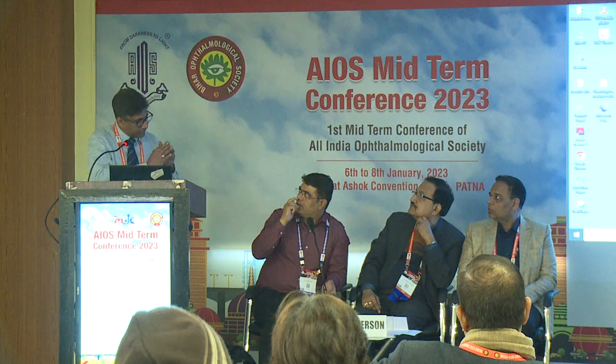And I also do the same sequential 2-stage rhexis. I showed it in 2011 at ESCRS, and I've been teaching for years the same technique which you have shown. And I make a very small 1.5 millimeter rhexis. Try to make it as small as possible. The difference is probably that you don't decompress.